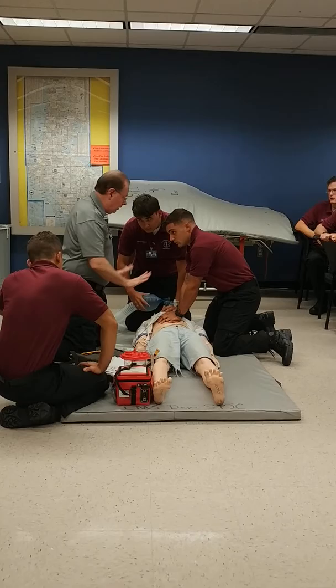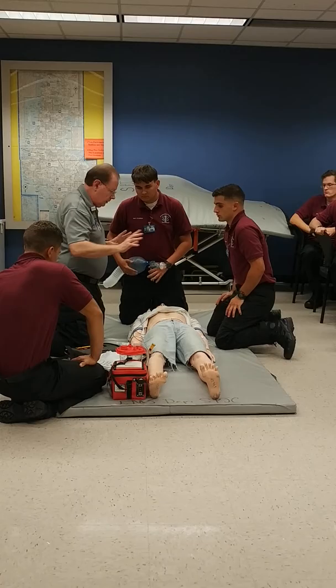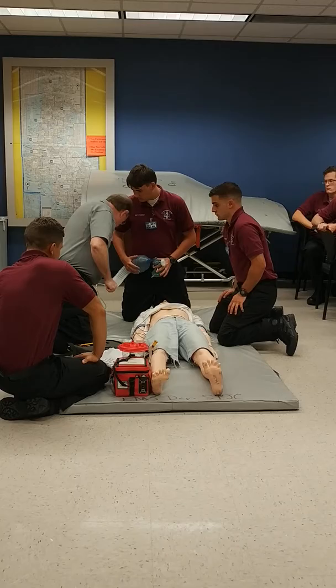Then what would I need to do? Get everybody out of the way. I'd put my finger on the button, with my eyes on the patient. We're going to keep here until we finish that two-minute cycle.